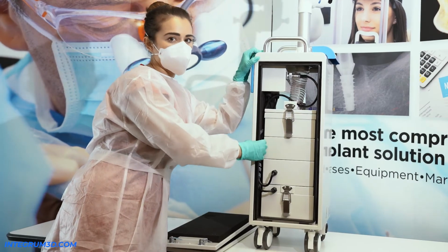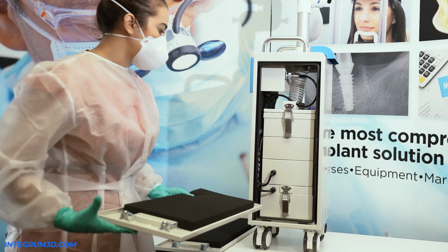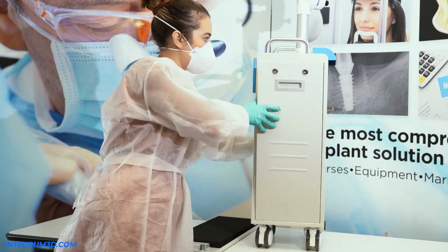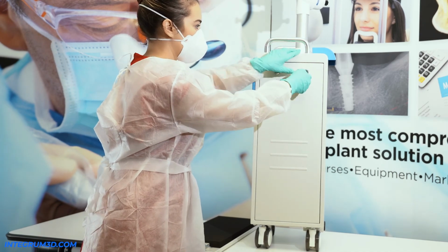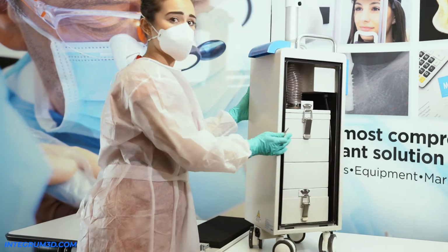After I've tucked away the cords, just tuck them nicely to the side, I grab my panel, and you want to tuck these little guys in very nicely, and then close it and lock it in place, nice and easy. Then you want to turn it around so we can do the other side.